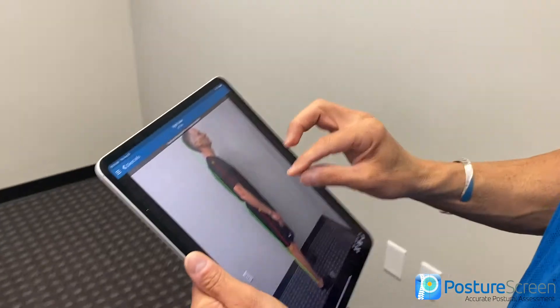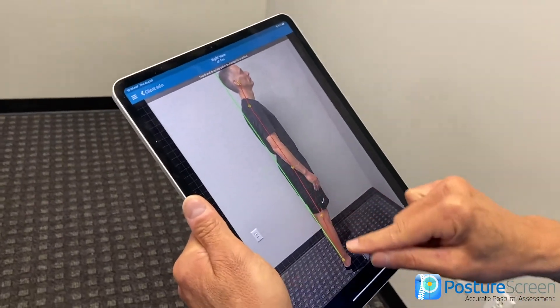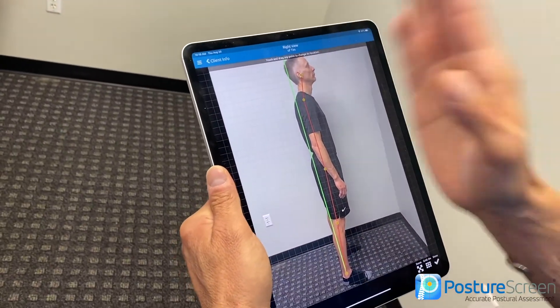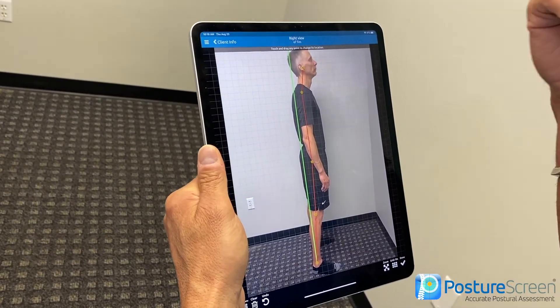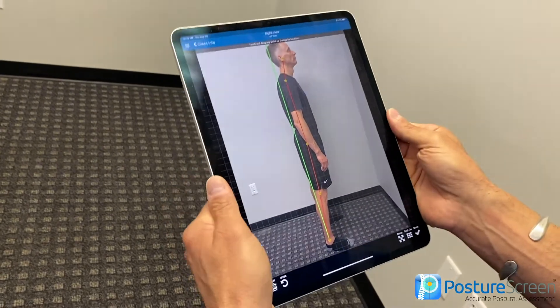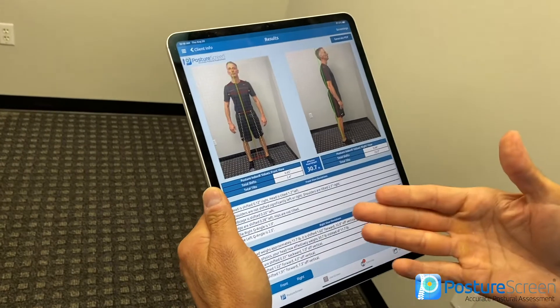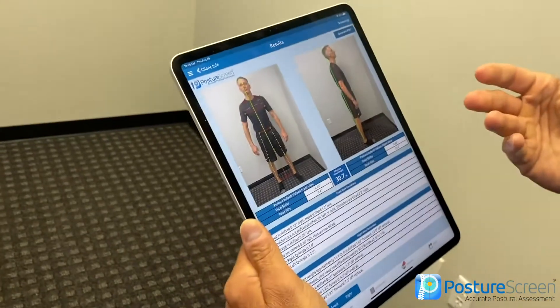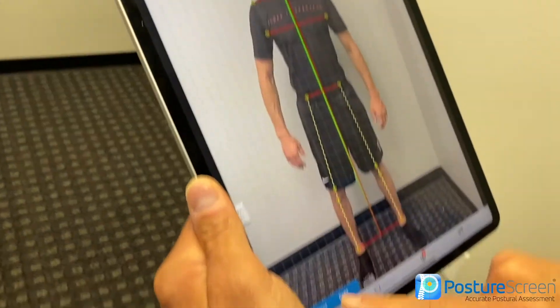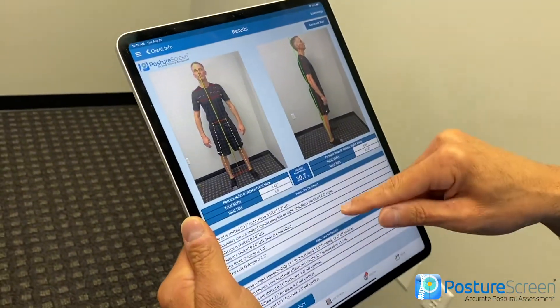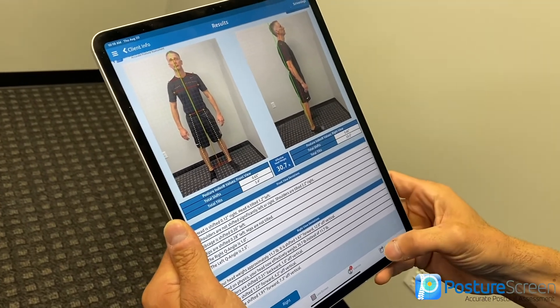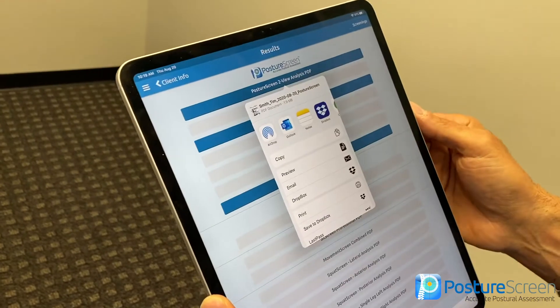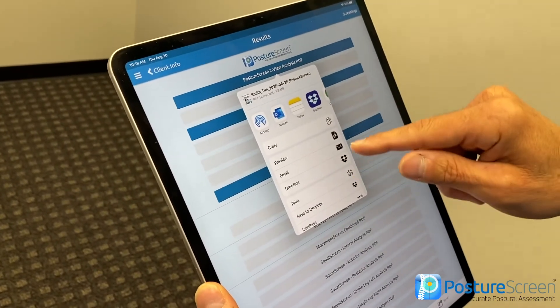Also keep in mind that the second view should always have the patient or client facing to the right side — your right side. At this point, hit Done. If I wanted to show the patient their results, I could scroll through and talk about their head weight. If I wanted to send them their results, all I have to do is hit Send to View PDF.